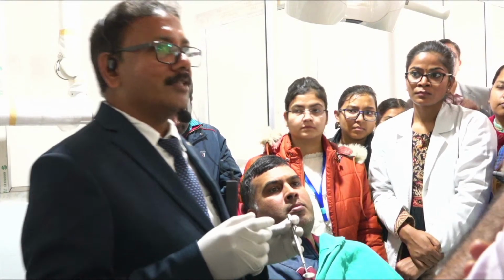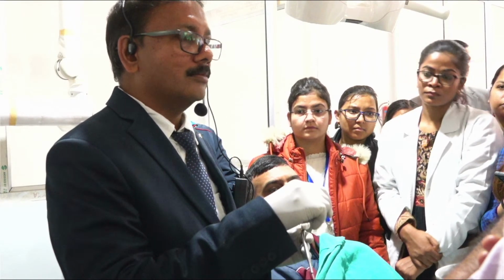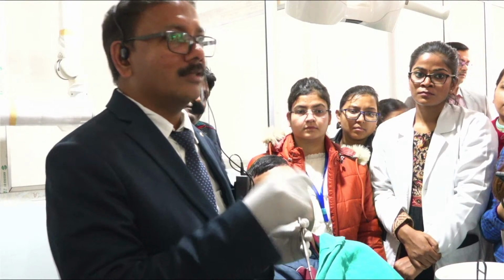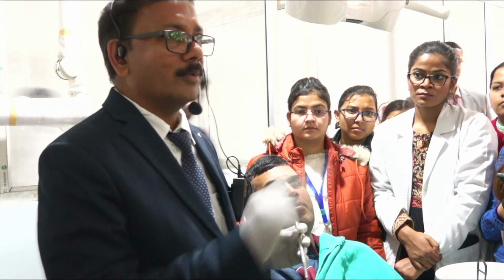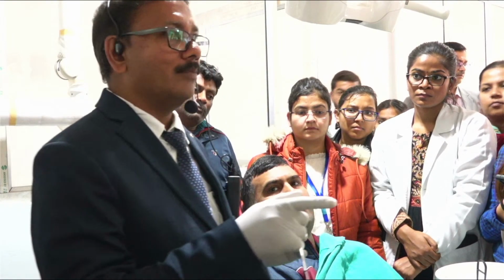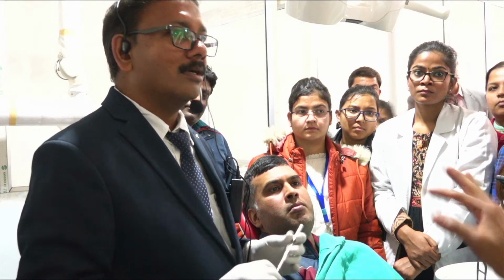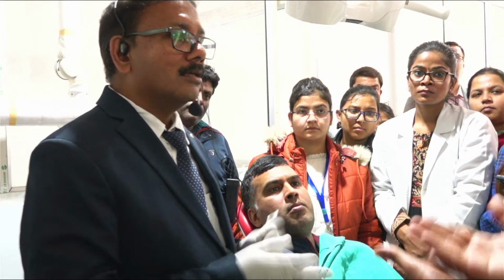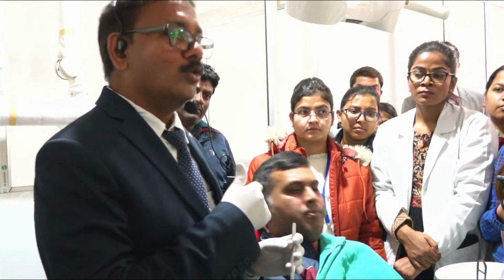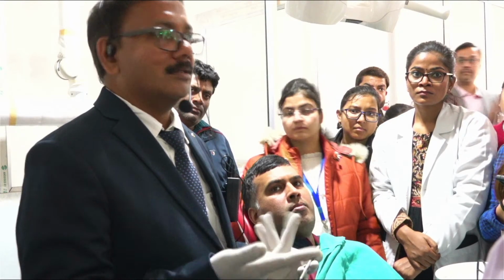Depth of penetration again depends upon whether you are doing it on the enamel surface or on the pulp, right? If you apply it to the pulp, you can remove the necrotic tissue. But if you are talking about the burr and the exposure of the pulp, better always go for... No, sir, I'm not talking about pulp. I'm just talking that for caries you can't debride, you can do the PDT and kill off the microorganisms there, and then put the GIC directly without using the burr.